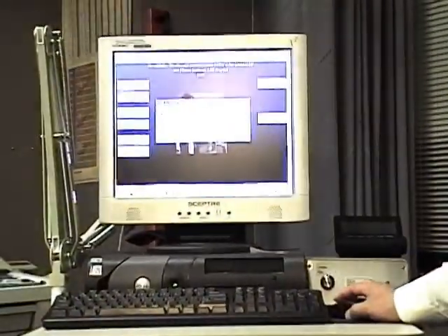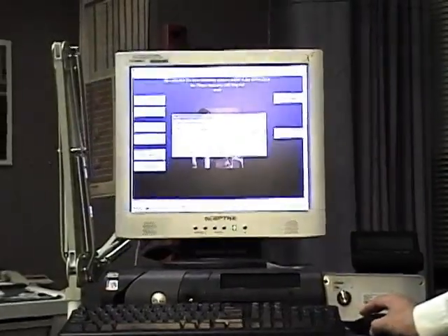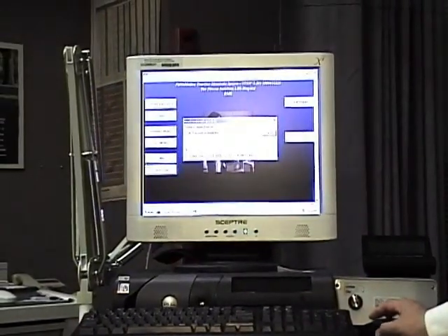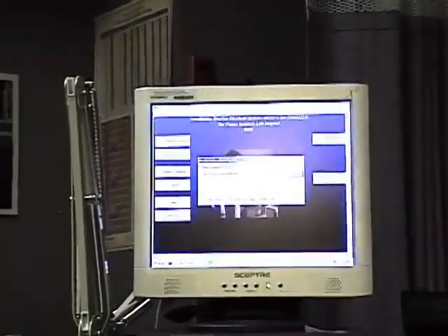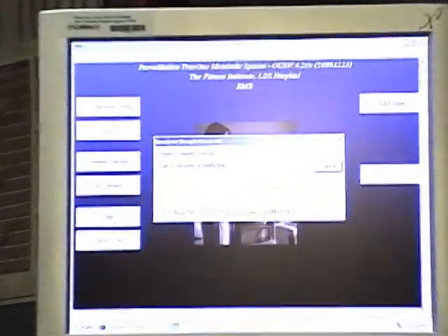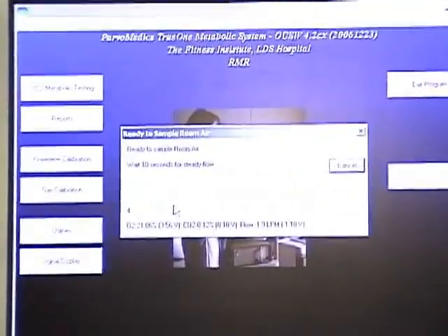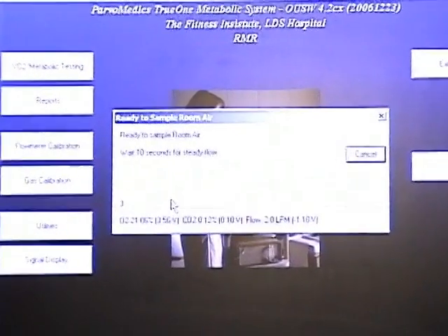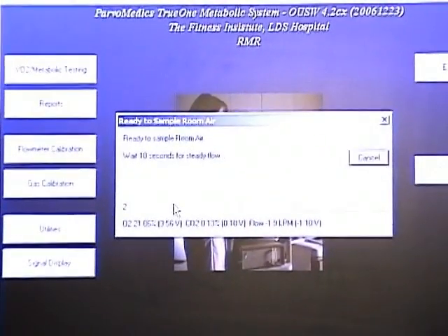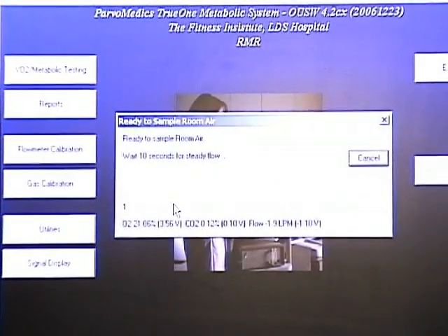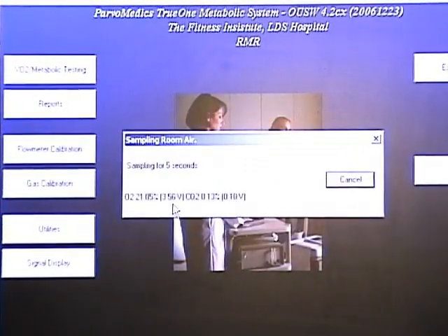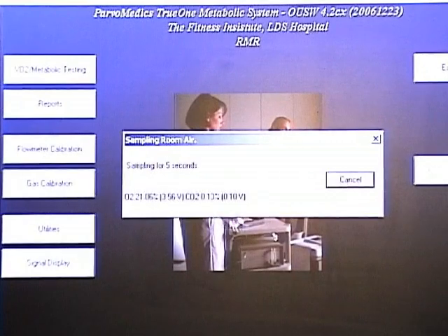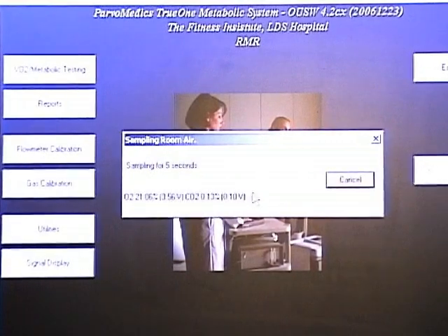Click OK. The program will wait 10 seconds for cal gas to be stable, 5 seconds to sample.